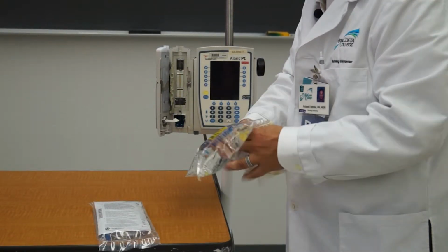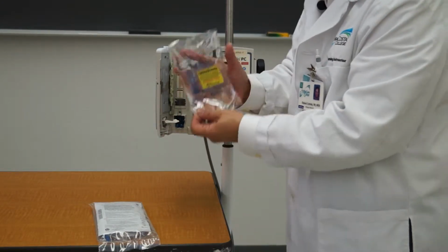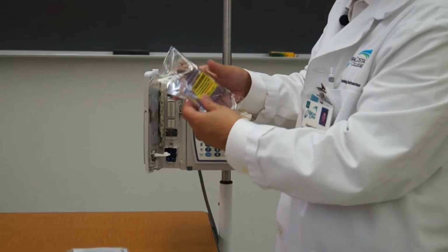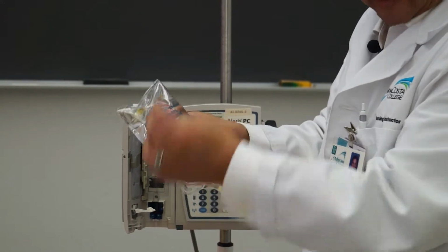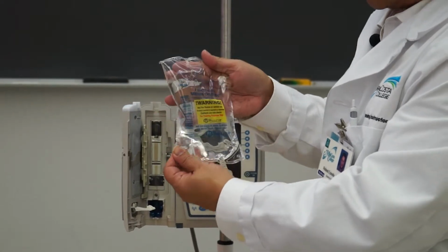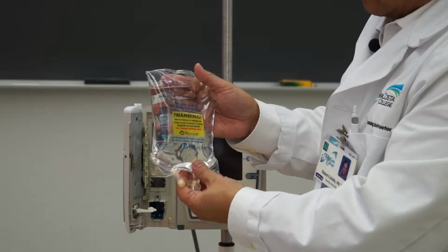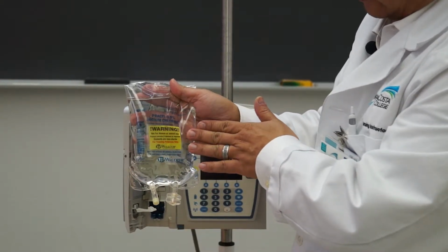It is common though that sometimes when you sterilize these with the gas sterilizer that there may be some condensation, and that's normal. So how you can tell is you can just check the pliability of the bag to see if there's any active drainage or active leaks. If there is, you would discard this and get a new one. In some hospitals, they want you to label the bag with the patient's information on it, which we will pretend or simulate that it is now labeled.